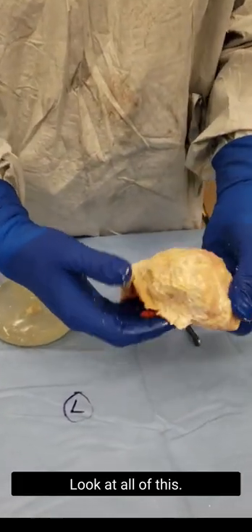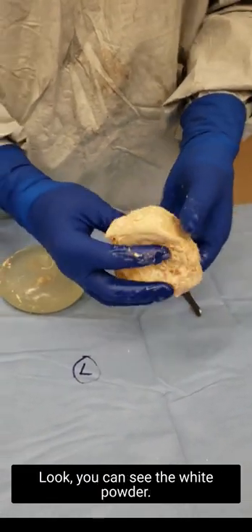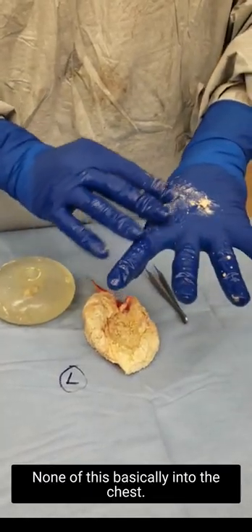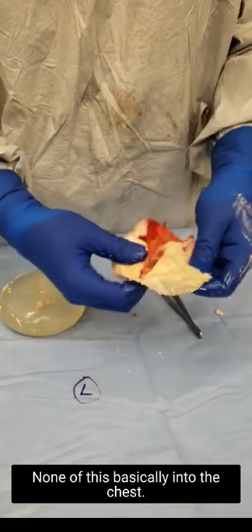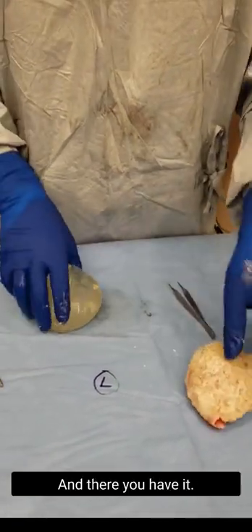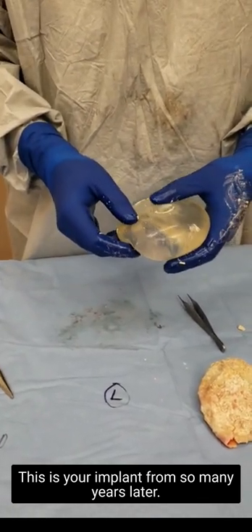Look at all of this — all of this badness was contained. None of this spilled into the chest. Look, you can see the white powder. None of this basically spilled; everything was done in an en bloc contained fashion. And there you have it — this is your implant from so many years later; I cannot even read what the name of it is.